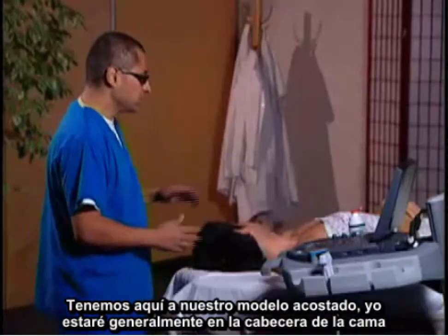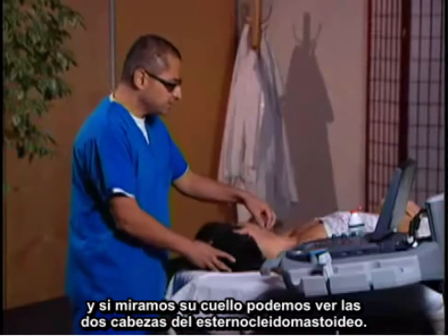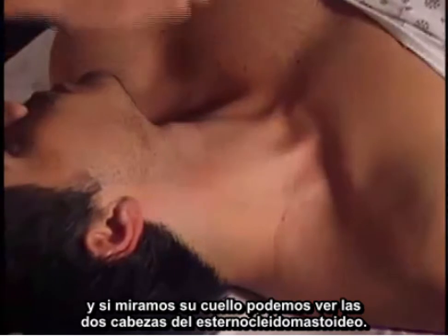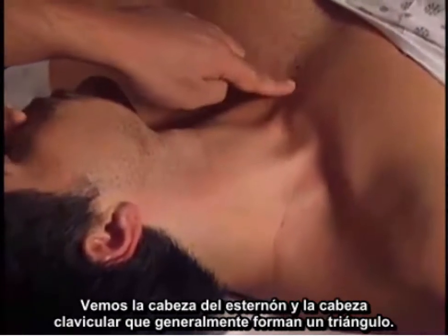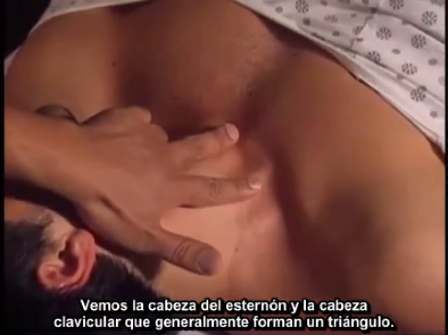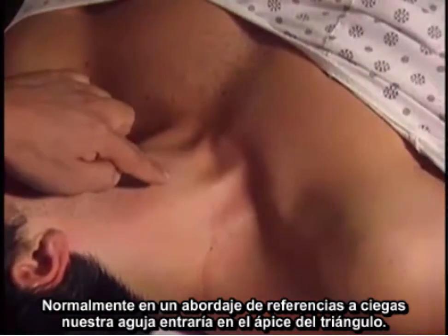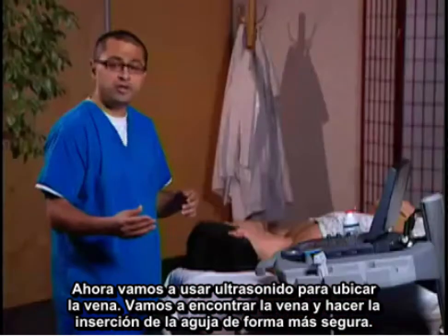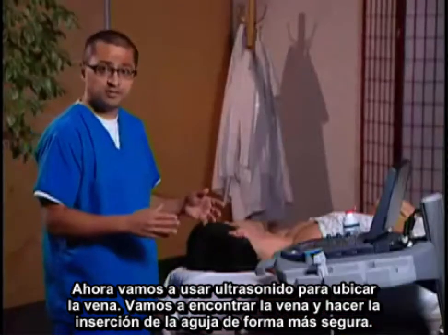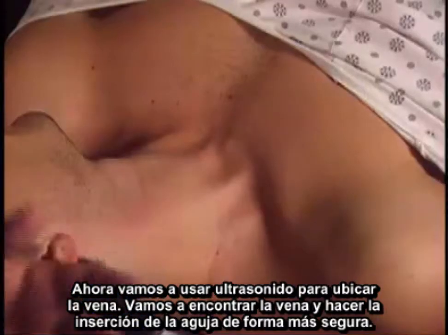We have our model here lying down. Normally would be at the head of the bed, and if you look at his neck, you can actually see the two heads of the sternocleidomastoid. We see a sternal head and a clavicular head that usually form a triangle. Normally in a blind landmark approach, our needle will be going to the apex of the triangle. We're now going to use ultrasound to localize the vein. We're going to now find the vein and make the needle insertion so much safer.